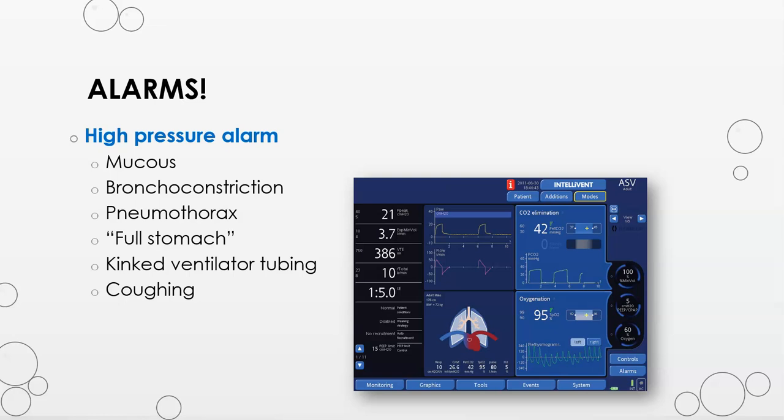Another thing to consider is that these tubings have humidification in them and it can accumulate in dependent areas. So it's not unusual to have areas where there's a lot of water accumulating in the tubing, which can increase the pressure and cause the high pressure alarms to go off. Assess the breath sounds. Was there a sudden episode of bronchoconstriction or a new pneumothorax? Have the lungs suddenly become less compliant? These are all things to consider.